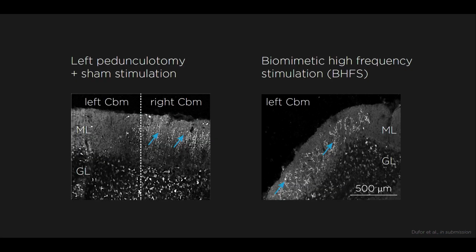One can also do TMS in a rodent model. And so this is a collaboration with Rachel Sherrod from France. We looked at magnetic stimulation, low-intensity magnetic stimulation in a rodent model, and also in an in vitro brain setup. In this model, they did a very interesting experiment in which they surgically removed the innervation between the inferior olive and the cerebellum in mice.